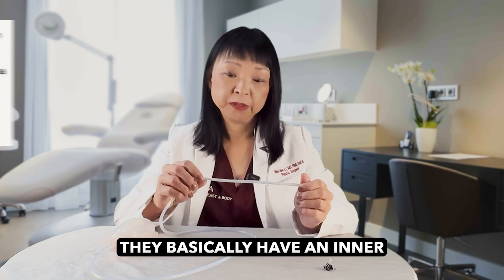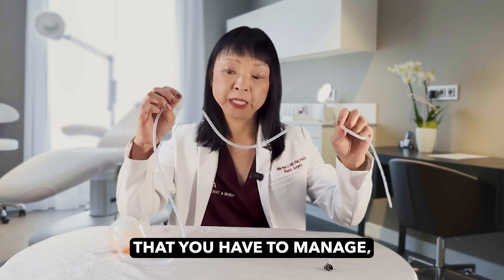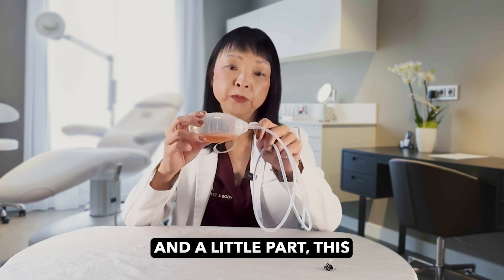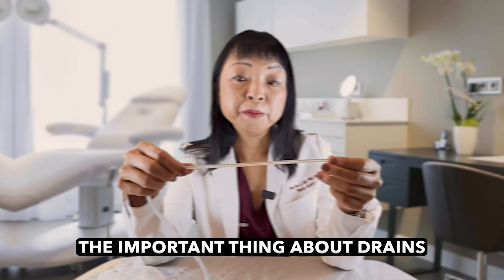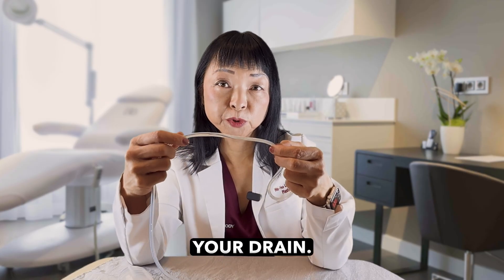All drains are very similar. They basically have an inner tubing and an outer tubing that you have to manage, and we're going to show you that a bit later. There's also a bulb, also called a hand grenade, that collects the fluid. The important thing about drains that patients need to know is that you can get an infection from your drain.